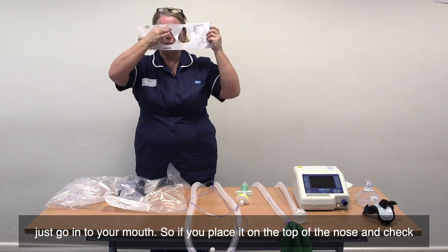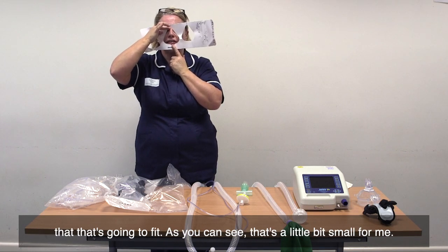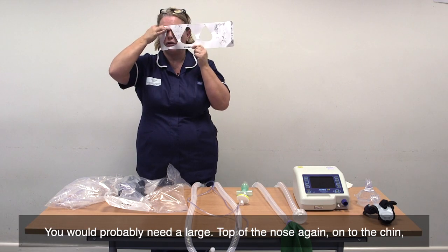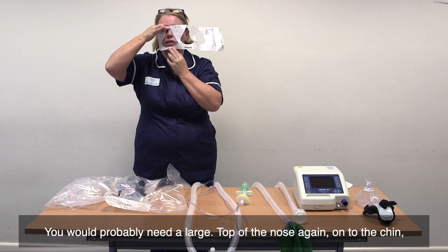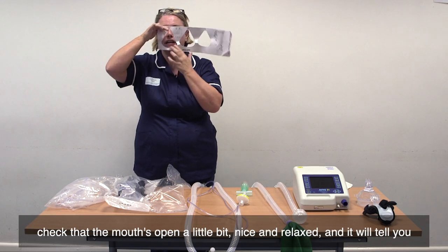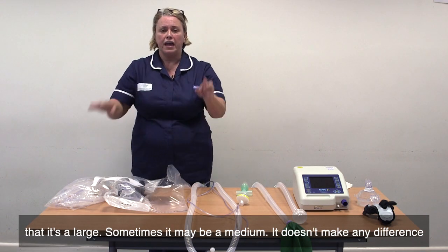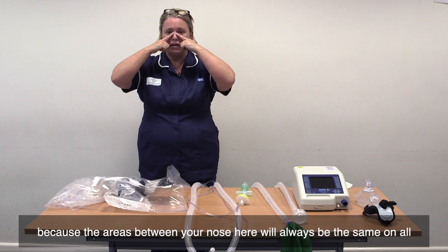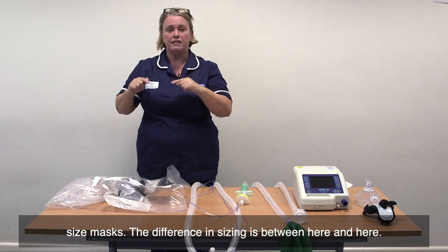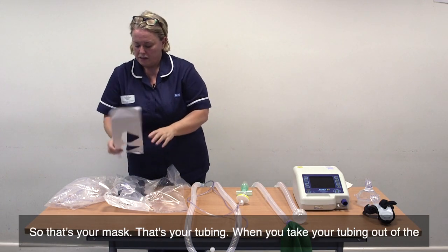If you place it on the top of the nose and check that it's going to fit — as you can see, that's a little bit small for me — you would probably need a large. Place it on top of the nose again, onto the chin. Check that the mouth's open a little bit, nice and relaxed, and it will tell you that it's a large. Sometimes it may be a medium. The areas between your nose will always be the same on all size masks; the difference in sizing is between here and here.